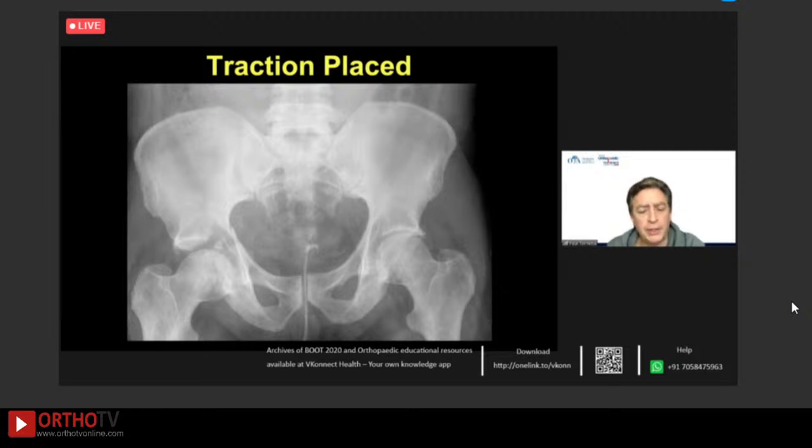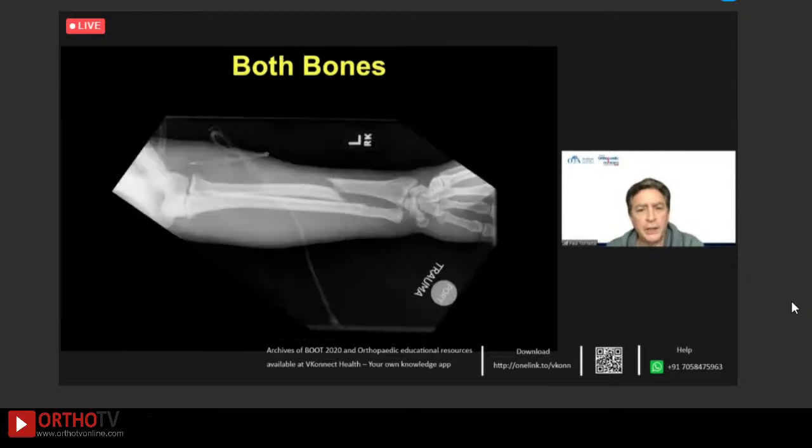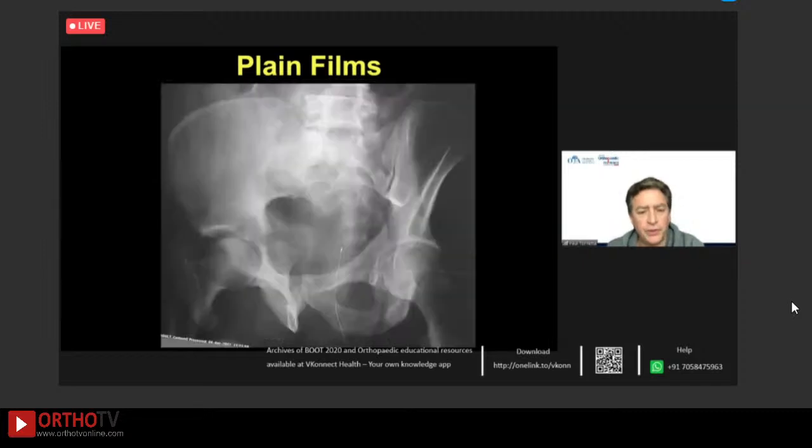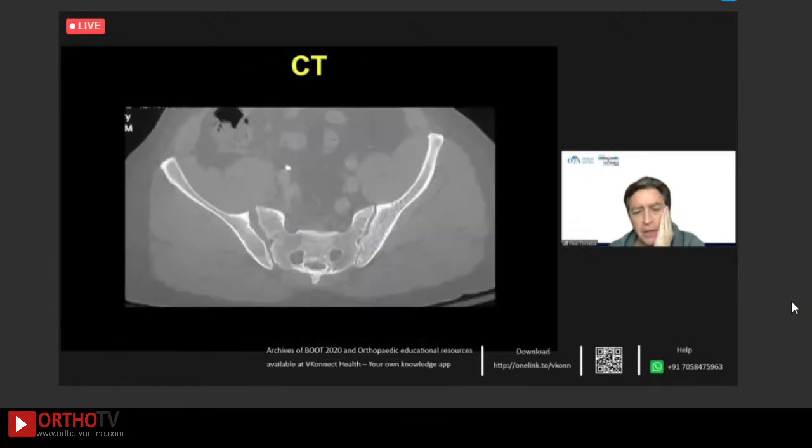And I think that people get tricked into doing these in the prone position, where the SI joint opens and then you can't get your transverse reduced. So people who do them lateral or supine are probably in a little bit better shape. This was just the both bones that we also fixed. So here you can see the plain films. It's a transtectal transverse, more oblique than most, coming out a little bit more inferior at the bottom.